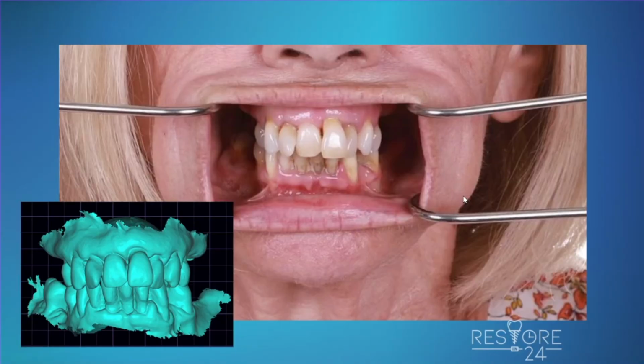But here's another view of Miss Peggy's smile. So what we can see here is we have a lot of bone and gum recession, missing our back teeth in both areas. Our teeth have drifted downwards over time, and everything's just very constricted. And so we're just trying to regain everything back here. And below on this bottom left, you can see what the lab did.